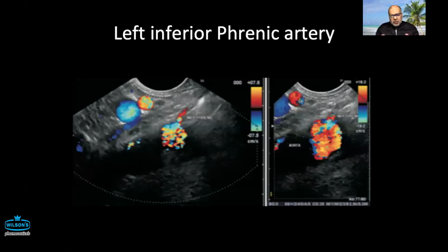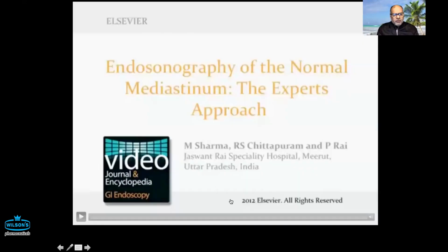Because I showed you the pictures, they were disjointed. But we're going to look at the actual performance of the echocardiography, this endosonography in the mediastinum, and then you can understand many of these things while we're playing it. If you have any questions, we can keep on posting them and discuss it after this. Okay, so let's see how it goes.